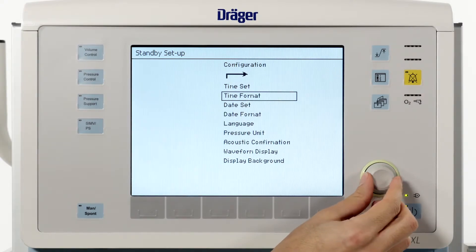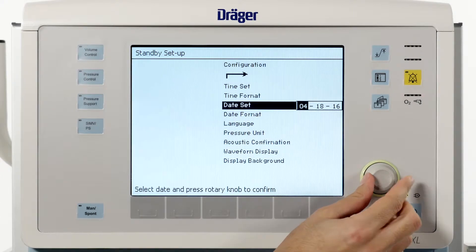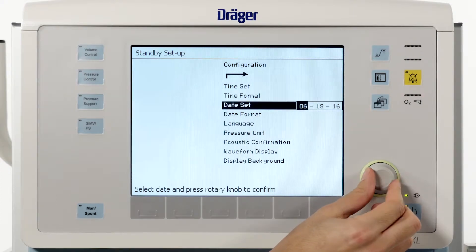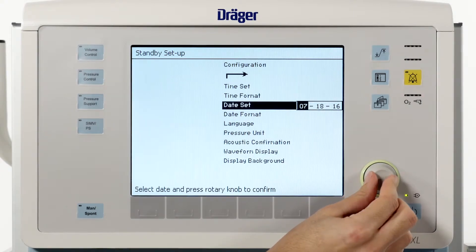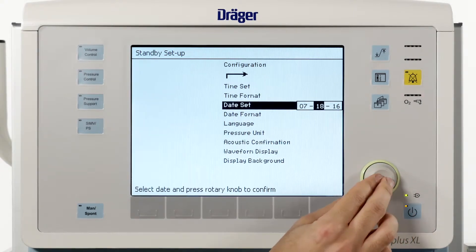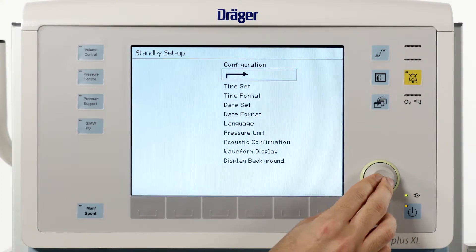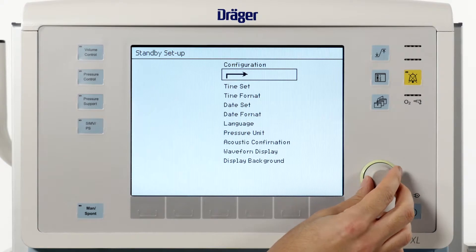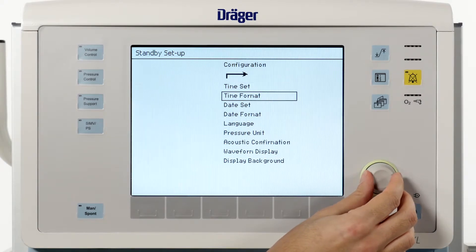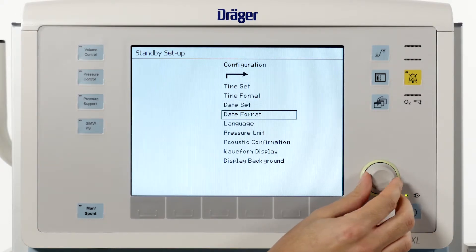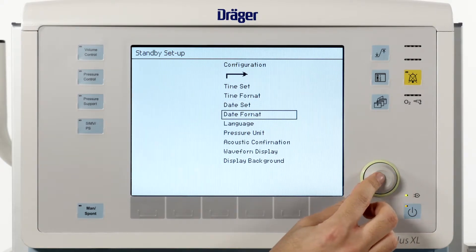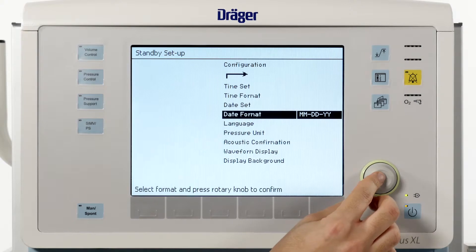You are also able to change the date via the next entry called date set. Date format lets you choose between two date formats.